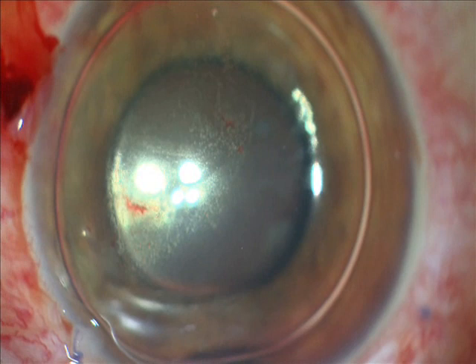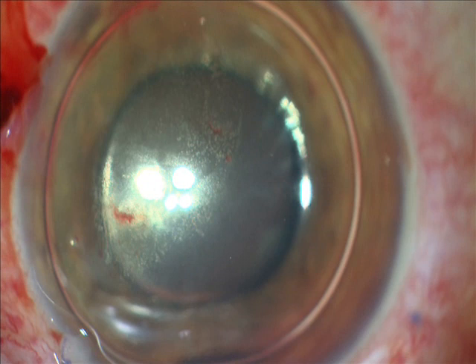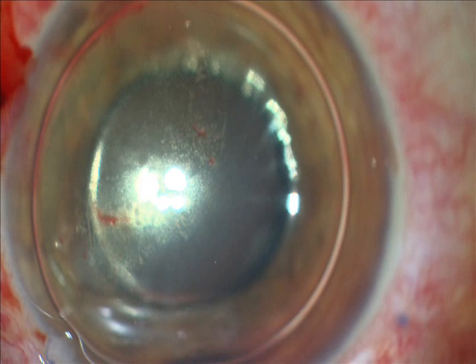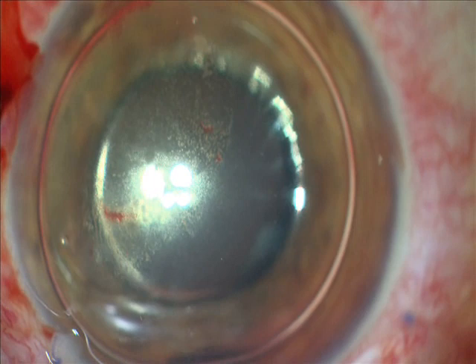You see that the center is almost clear. I will put more air to have very good support and help reposition the Descemet's detachment from inside to the corner.